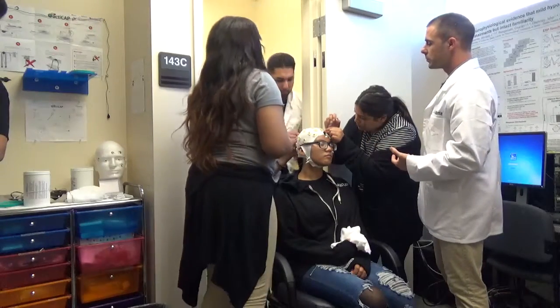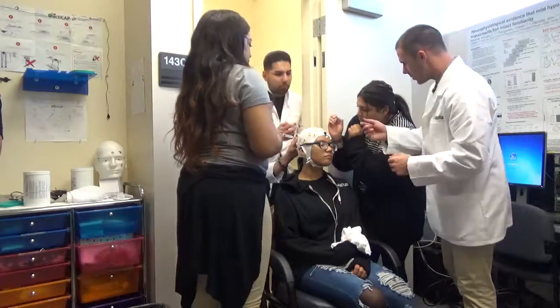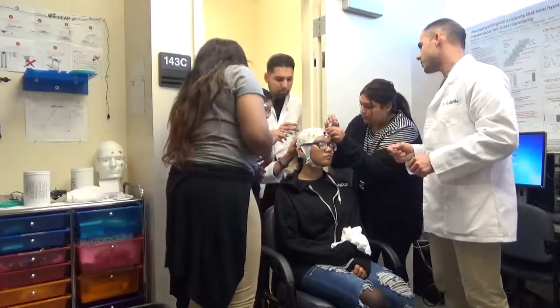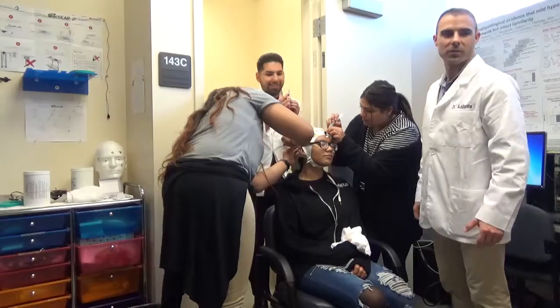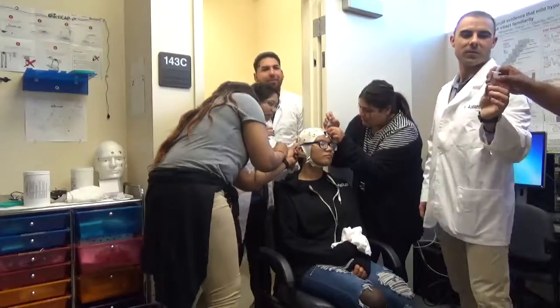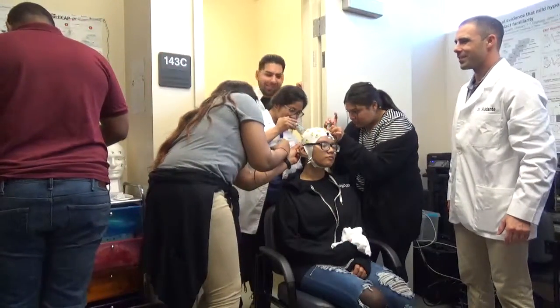Okay. So that's not how you hold it. Which one? This one? Or, well, actually, no. I'm sorry. I thought you were injecting gel. No, sorry, I'm scraping. I'm all out. I need more ammo. Okay. Who wants to reload? No, man. That's really nice.